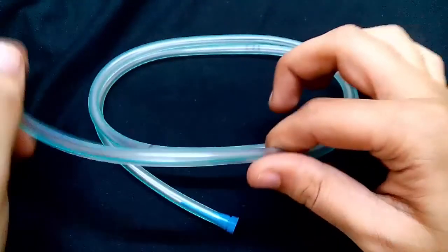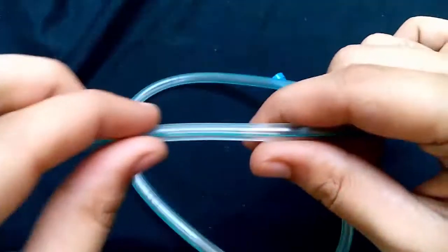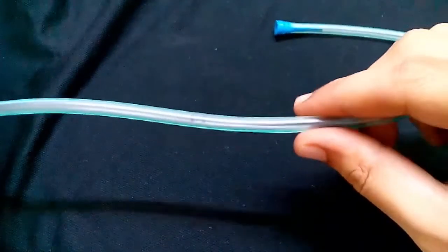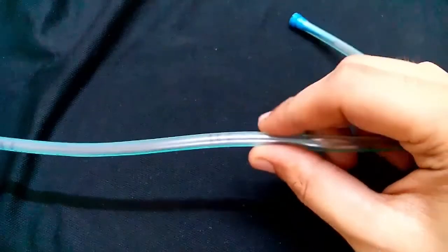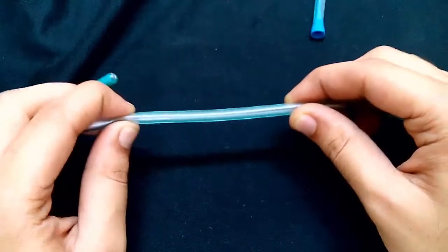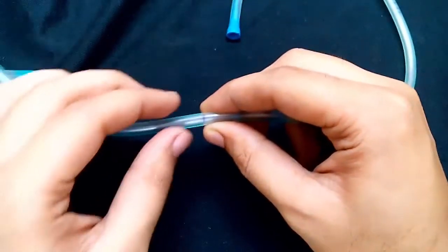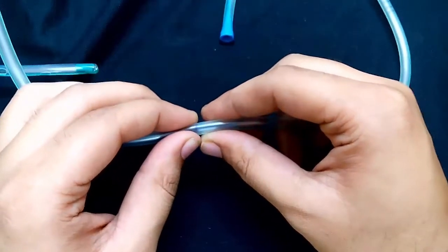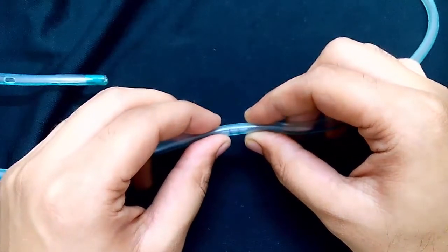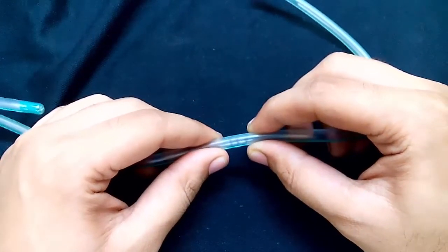The body of the Riles tube also has a radio-opaque line. There are several marks on the tube at 50 cm, 60 cm, and 70 cm, and some tubes may also have a mark at 40 cm. The 40 cm mark indicates the cardioesophageal junction, 50 cm means the tip is in the stomach, 60 cm means the tip is in the pylorus, and 70 cm means the tip is in the duodenum.